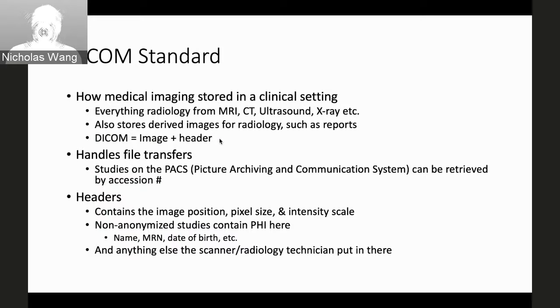Basically, a DICOM file is an image and a header. These headers are standardized in a way that you can store a lot of very useful information on how to read the image, how to interpret the image, and what the values are. But essentially, when you look at an MRI study, you'll get a stack of anywhere from 20 to 500 or many more, depending perhaps if it's a 4D volume, of these DICOMs. And you put them all together, and that makes up your MRI study.